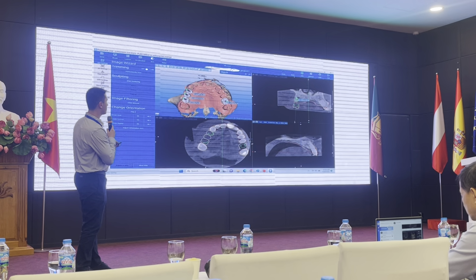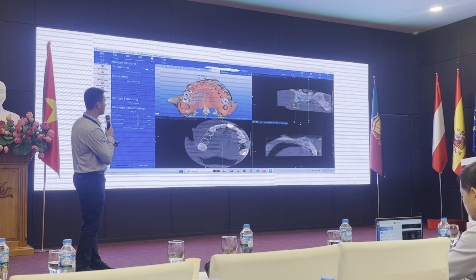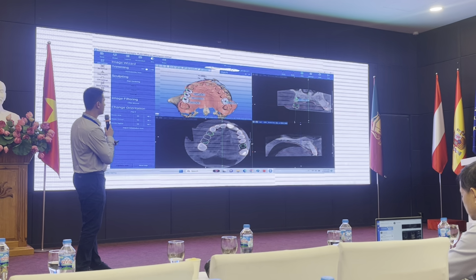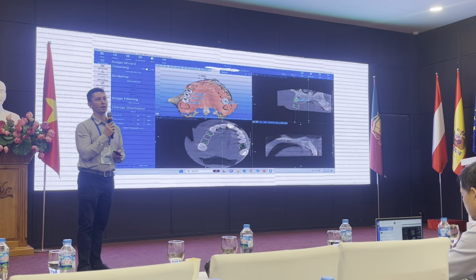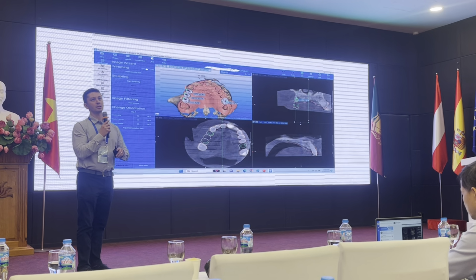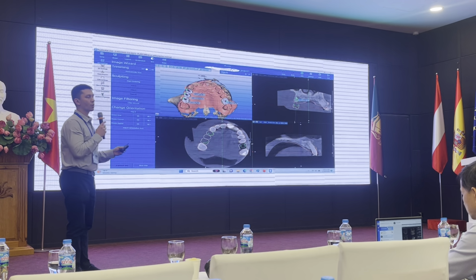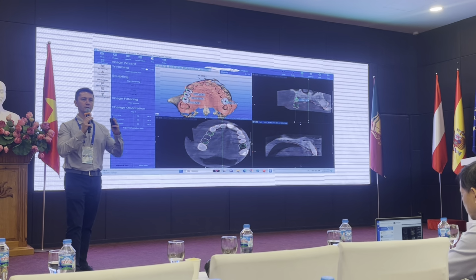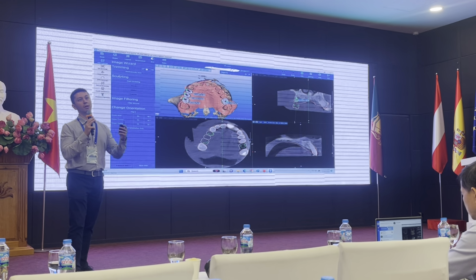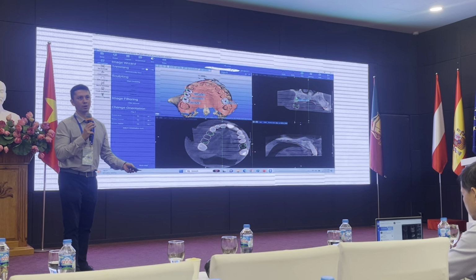Or we might only have room to put one normal size molar, and then we have to compromise or sacrifice on what the ideal shape of tooth could be. Or maybe we decide to not do any compromise at all, and we say, let's consider ortho. Let's consider Invisalign or braces to create more space before we do the implant surgery, because we've already planned where the teeth are going to go.